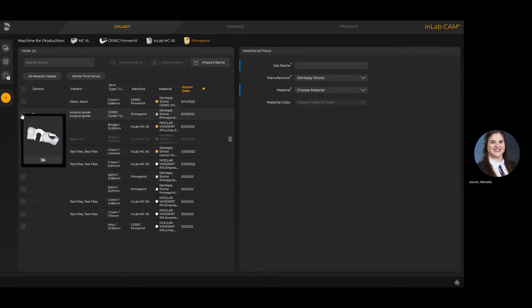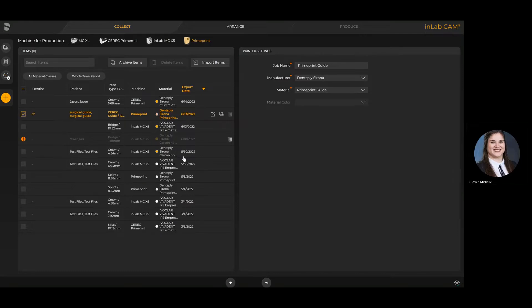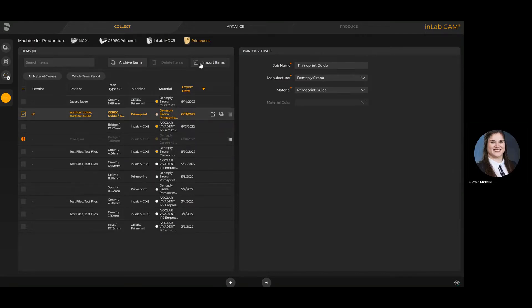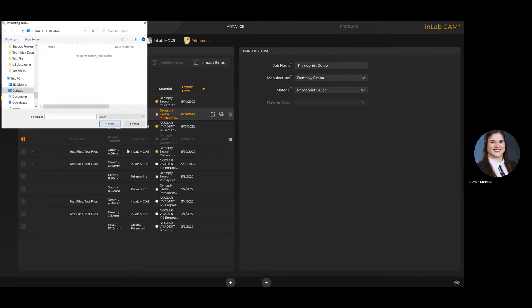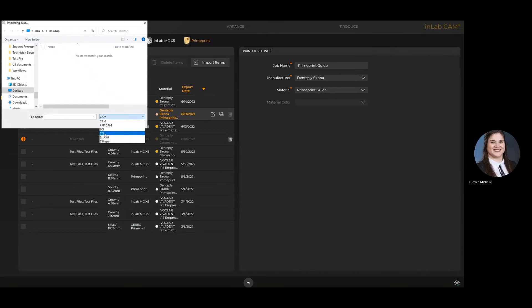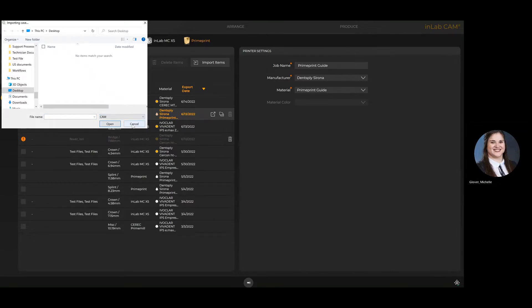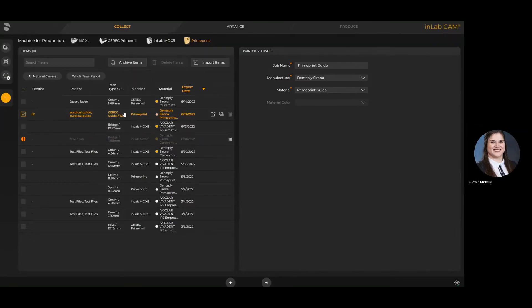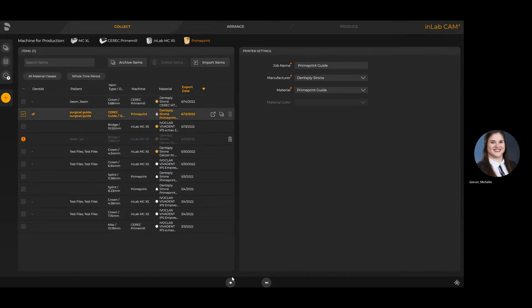When it comes to PrimePrint cases, if it's an integrated workflow meaning it's coming from CERC or InLab, it will populate in the list you see here. However, you also have the option to import items. The InLab CAM is fully open to import things like STLs, Exocad construction files, etc. For this particular demonstration, we're going to move forward with an integrated workflow.